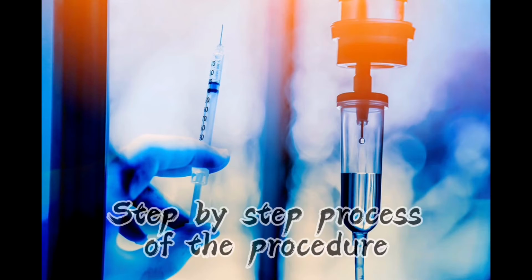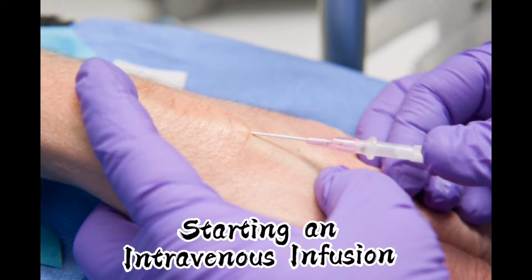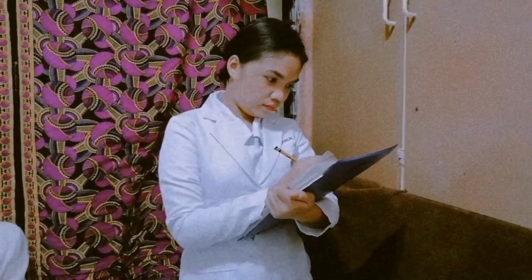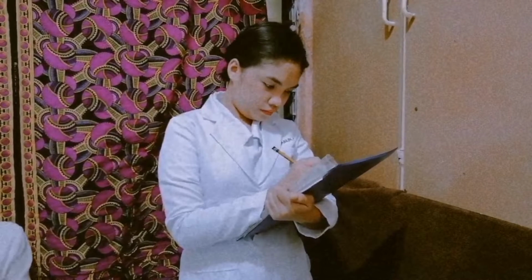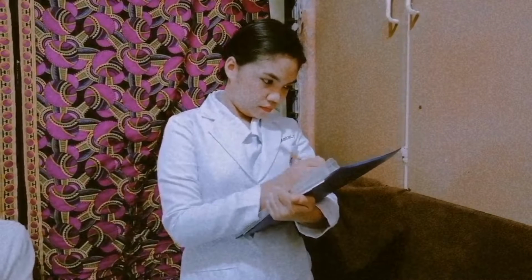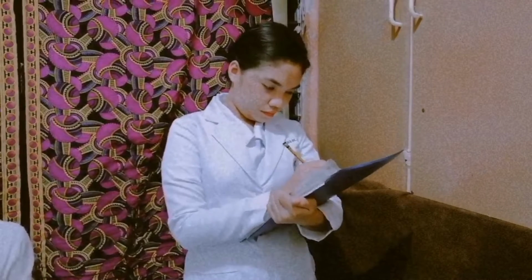So for today's video, I am going to perform an IV therapy which includes IV infusion, regulating flow rate, and discontinuing IV solution. Here are the step-by-step process of the procedure of IV therapy. So the first process is starting IV infusion. The first procedure is to check the doctor's order and make an IV label. This is to ensure that the client receives the correct IV solution and medication as ordered by the physician.